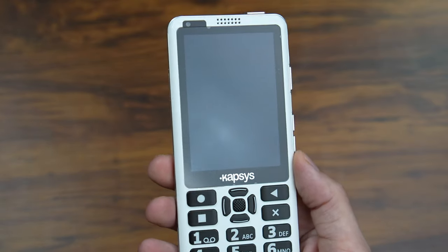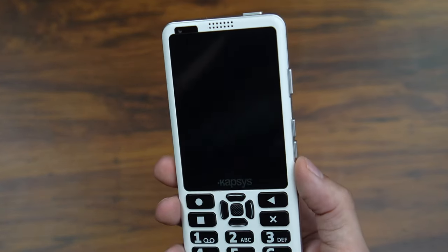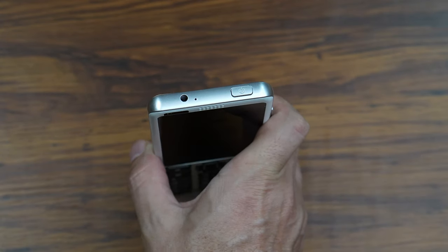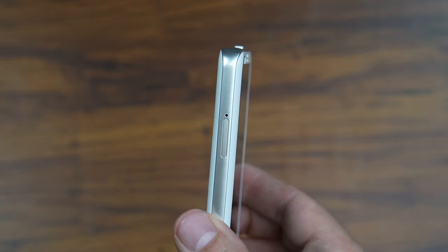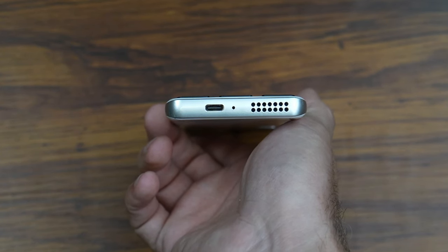So even if the user has more profound vision loss, they're still going to be able to use this phone. The front side of the phone is split into two main sections — the upper half being the touchscreen and the lower half being the full physical keypad. On the right side we have three buttons: volume up, volume down, and the upper button triggers the Google Assistant. Across the top we have the power button and a 3.5 millimeter headphone jack. The phone does have Bluetooth so you can connect to Bluetooth audio devices, but it's always great to still have a headphone jack as well. Along the left side you have the dual SIM card slot, so you could have two different phone numbers associated with this one phone.